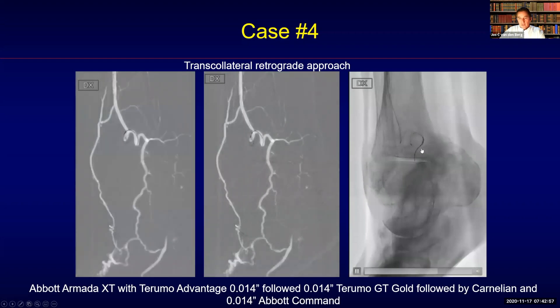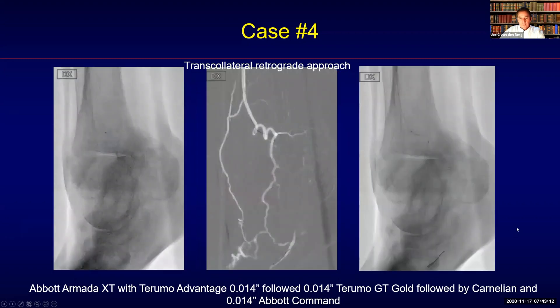I then went back down with my guide wire for support. The Terumo Advantage is more supportive than the Terumo GT Gold, but with the GT Gold it was possible to cannulate the collateral, as you can see here. The bends are already straightened out quite nicely, and the guide wire has crossed the collateral towards the distality, going into the lateral plantar artery.